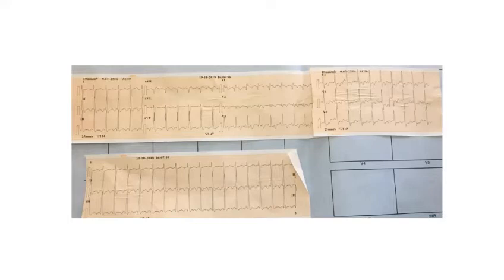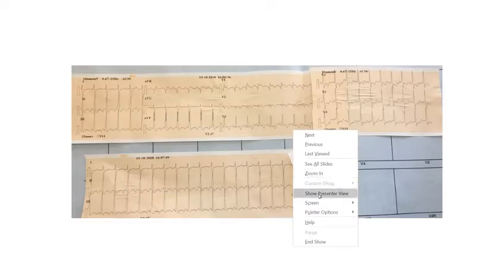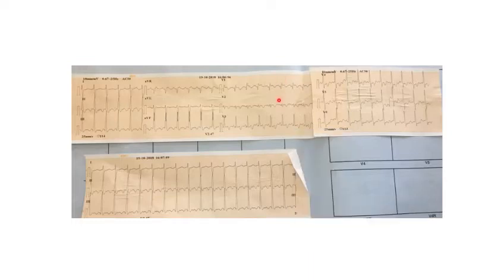Why are you saying all these diagnoses? What is the evidence of RVH? Sir, there is an S wave in V6. Or is it a smaller S and R dash pattern? No, it's not an RSR pattern, it's QR. If you look at these leads, let me see whether I can show you. Do you think that here there is an R wave, a small R wave? No, that is Q, sir, Q for me. Is there a small R wave preceding the Q? Here also there is a small R wave. Okay. Can you see? It seems that it is more of an RSR dash pattern than a QR pattern. Yes.